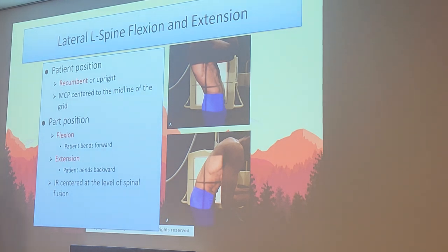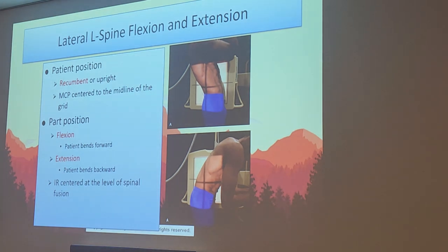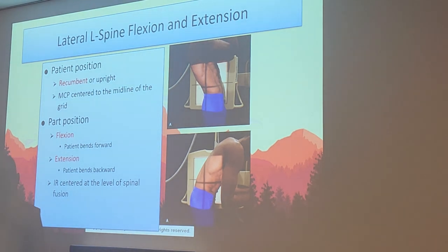So you have to look to your orders. Like they might say they had an L1, L2 spinal fusion. So you want to make sure you center up higher at the area of interest. Is this not in your book? It should be in your book. Page 503. Thank you, Shemeka. If it's L2, like you said, you center L1 and L2 and then you move them. Correct. You're centering first, then you move them forward or backwards.